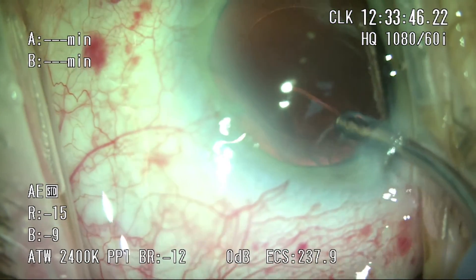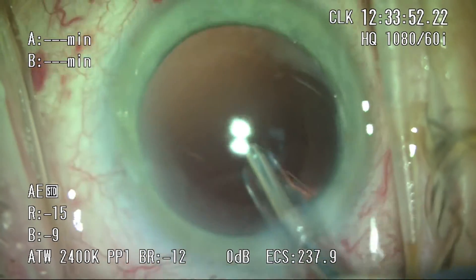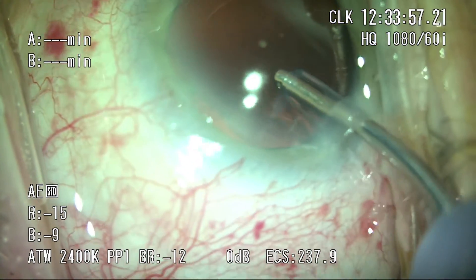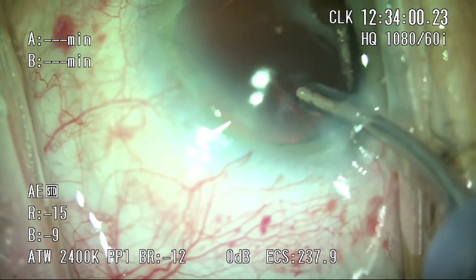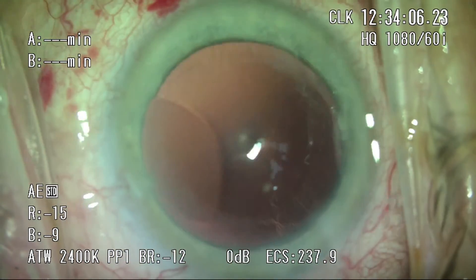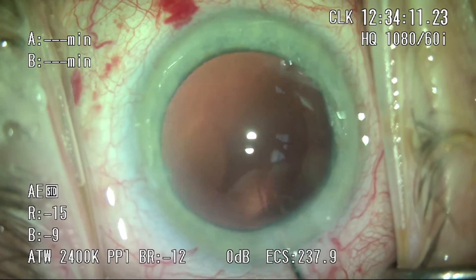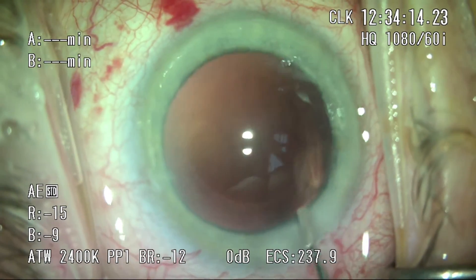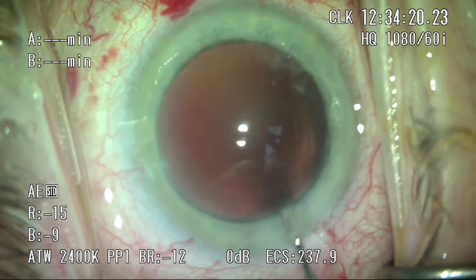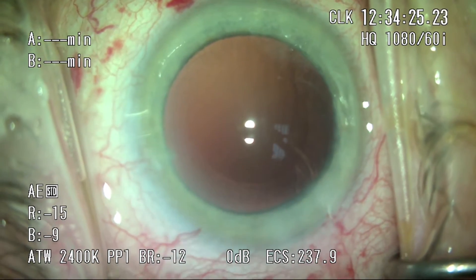However, with persistence and the chamber stability we have, I am able to completely remove all the cortex with a straight IA tip without requiring bimanual irrigation-aspiration. You can see a few petechial hemorrhages on the subconjunctival area over the sclera as a result of the suction — we do see a variety of subconjunctival hemorrhages, and this is a fairly average amount. For any remaining wisps of cortex in the posterior capsule or subincisionally, I find a 'power wash' — a good stream of balanced salt solution directed at the posterior capsule — is very effective.